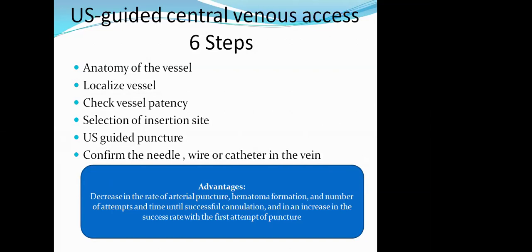So the first step is that when you are performing the ultrasound guided central venous access, you have to see the anatomy of the vessel under the ultrasound and localize the vessel, check the vessel for the patency, select the insertion site, and then you perform the procedure, the puncture with the needle, and then finally confirm the needle or wire or catheter in the vein. Now the advantages of this guided procedure is that it decreases the rate of the arterial puncture, hematoma formation, and increases the success rate in the first attempt.